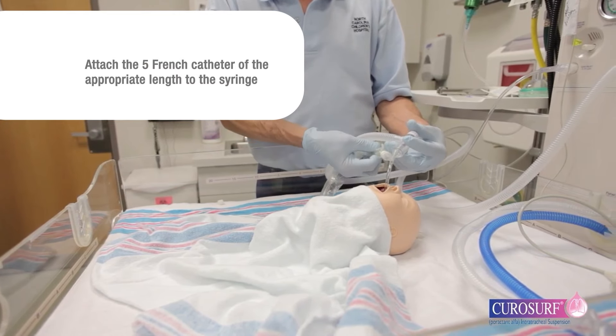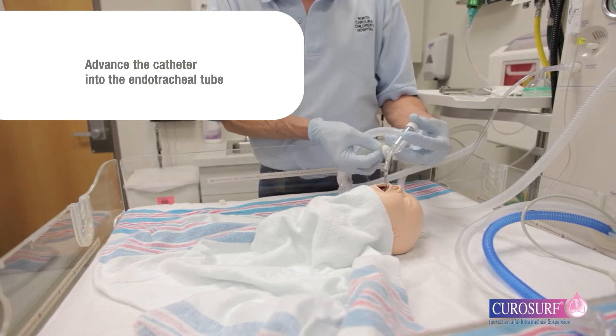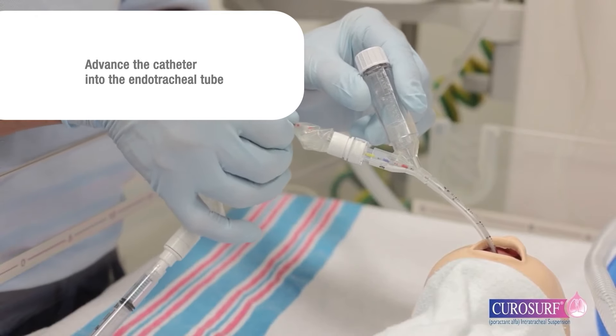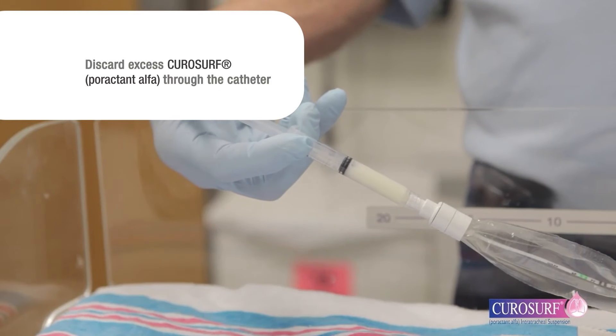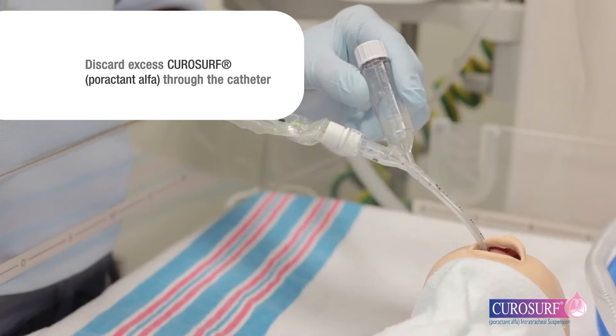Attach the 5-French catheter of the appropriate length to the syringe and advance the catheter into the endotracheal tube without going past the premeasured depth. Fill the catheter with CuroSurf suspension. Discard excess CuroSurf through the catheter so that only the dose to be given remains in the syringe.